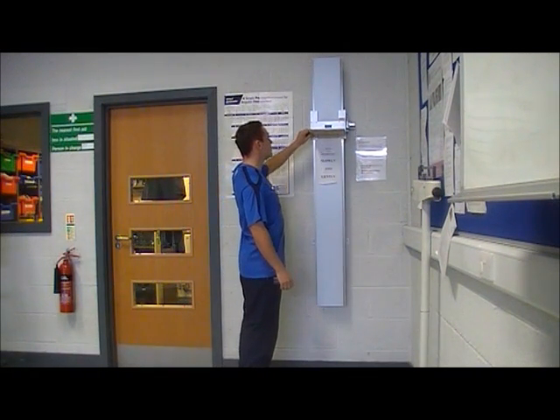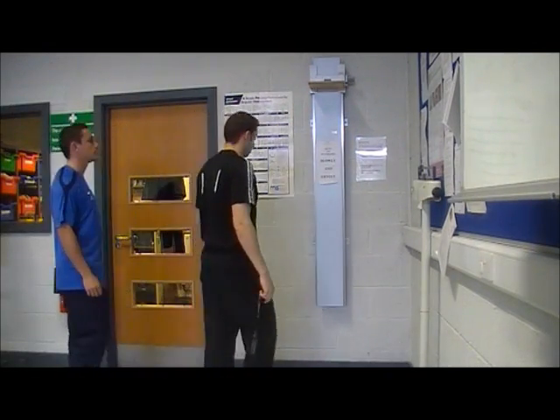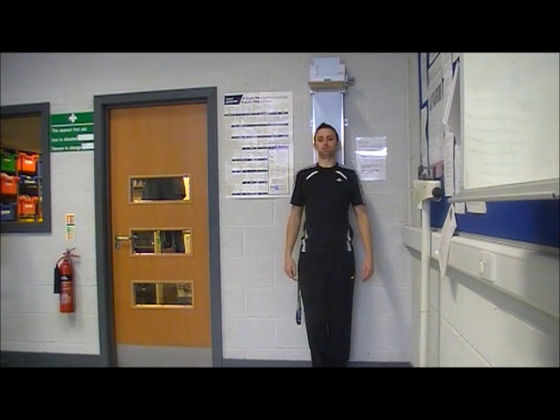Next, raise the boom so the participant can stand underneath. Ask them to stand with their heels against the marker on the floor.